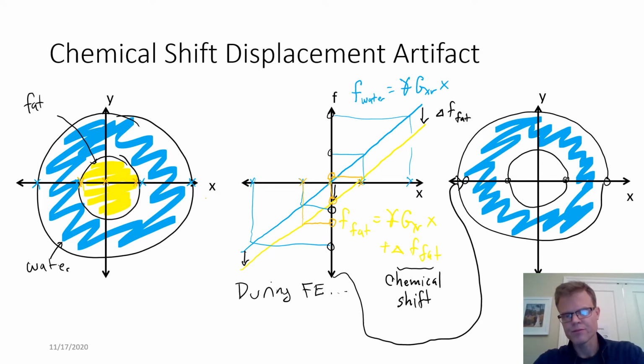What I've drawn here is that these points in space, the orange points, are mapped to frequency by the yellow points. When we look at the frequencies we get in the signal and follow this mapping back to our image, you can see that our original locations are going to be shifted because they are now represented by a shifted set of frequencies.